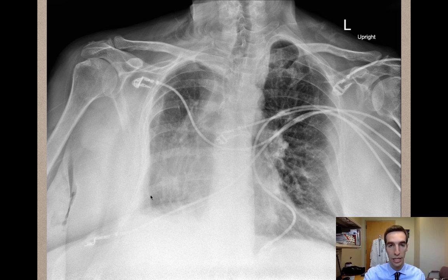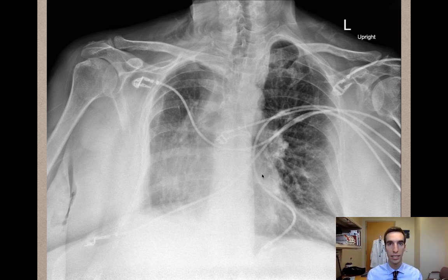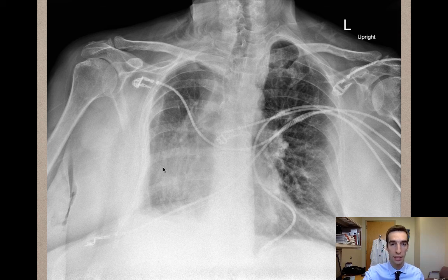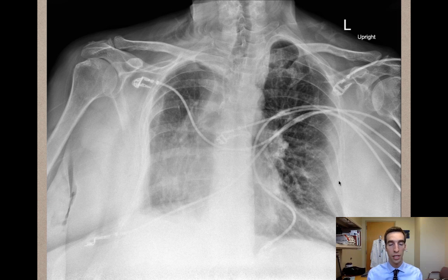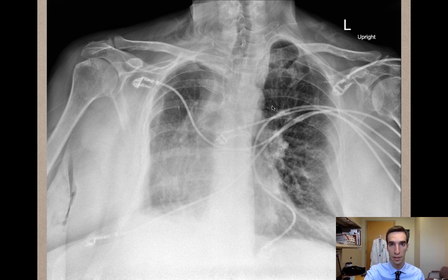This is what makes this x-ray interesting. Additionally, when looking at this chest x-ray, you may see that the heart is more than half the width of the lung fields. When this occurs, you might be thinking of congestive heart failure, and this might explain why there's so much congestion in the lung fields.